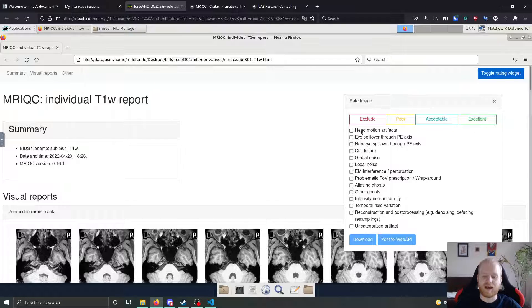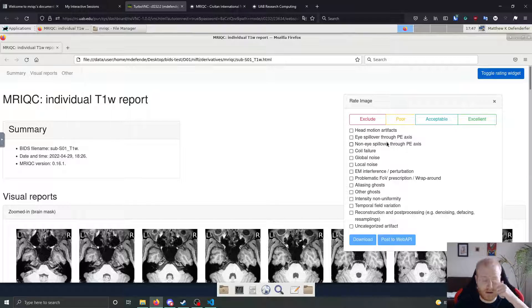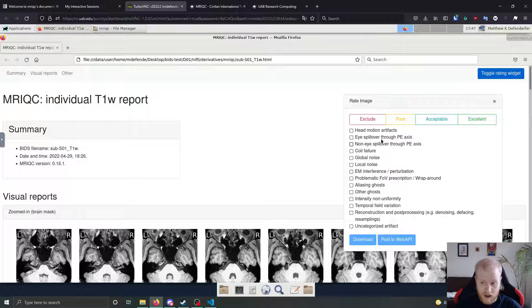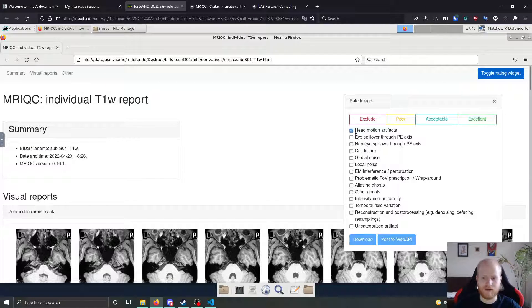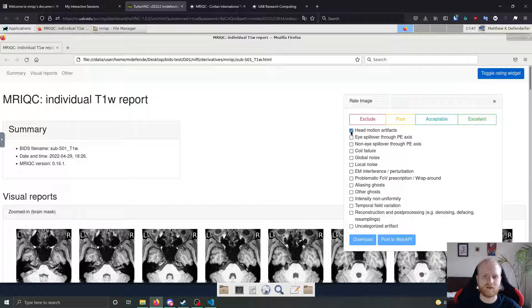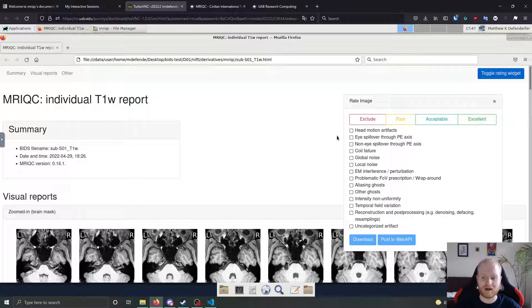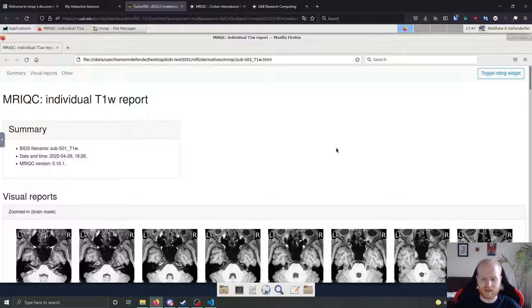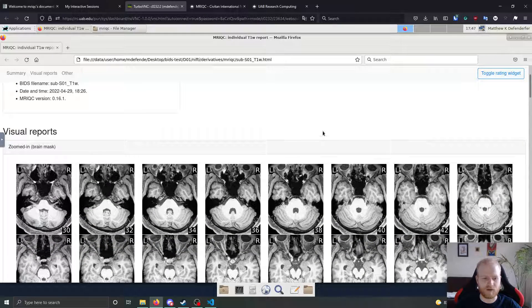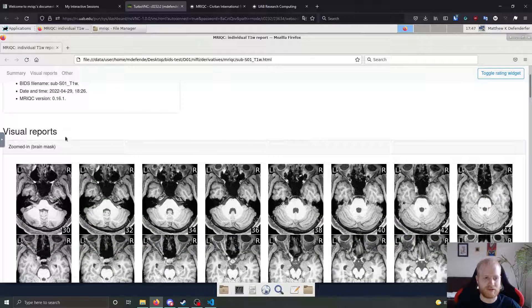And then you're going to have a rating widget over here where you can rate this image overall as either completely exclude it from everything moving forward. You can rate it as poor, as acceptable, or as excellent. And then you have a list of common artifacts that people see or have seen in other data. And as you're looking through, you can check these. Say if there's head motion artifact, you can check it here, and it'll hold that information for people to look at later on.